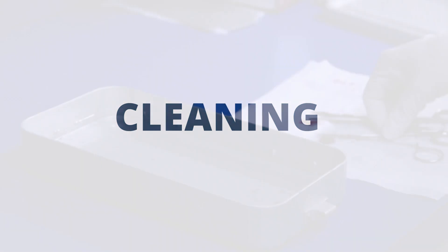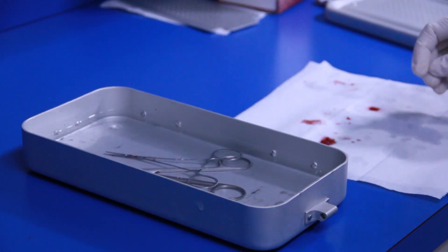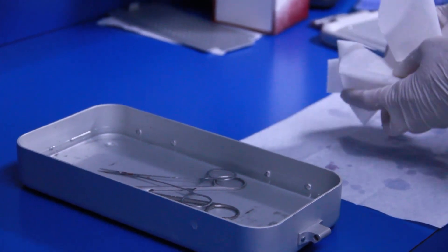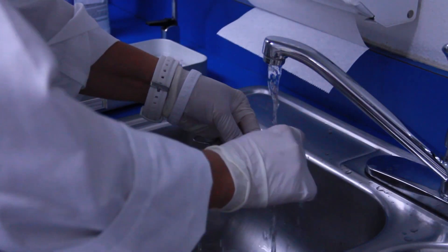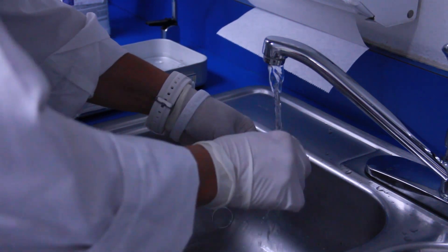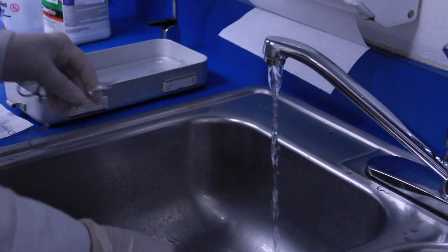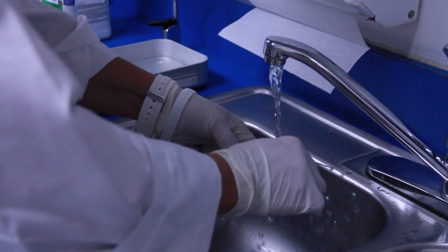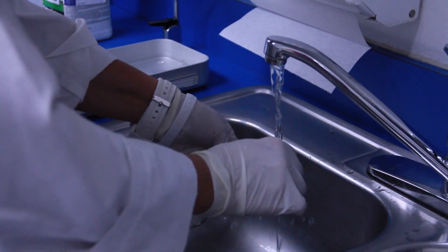Cleaning removes dirt, debris and biological material from surgical instruments. To maximize the usable life of your instruments, never allow blood to dry on surgical instruments. Within 10 to 20 minutes after a procedure, open all the instruments and begin a decontamination process. To prevent blood from drying on instruments, simply saturate a towel with tap water and lay it over bloody contaminated instruments.